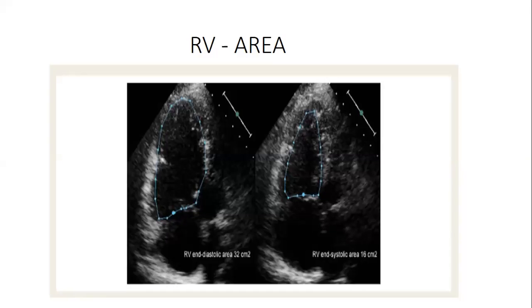When you track back, make sure you get your image in diastole. And when you trace in diastole, make sure that you don't include the trabeculated morphological structures, which I mentioned earlier, because that may actually distort and compromise your calculations.